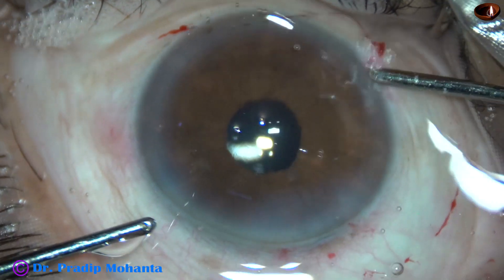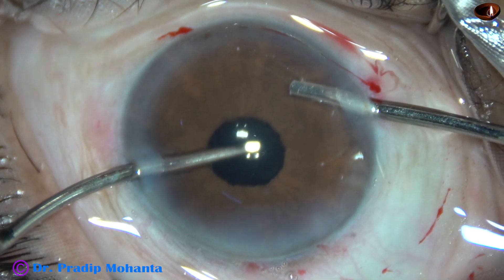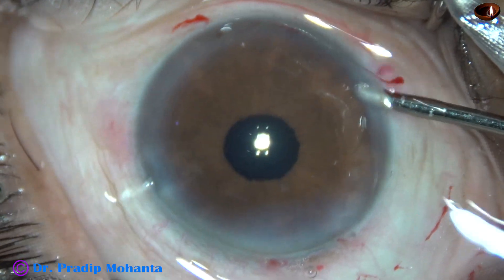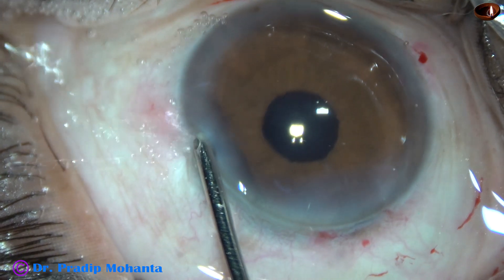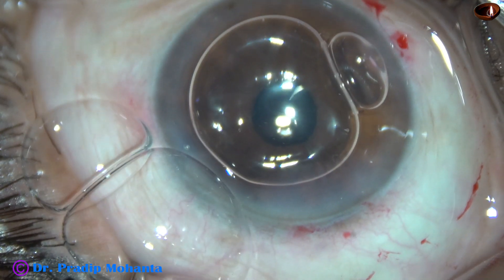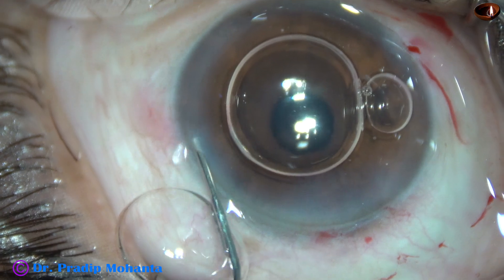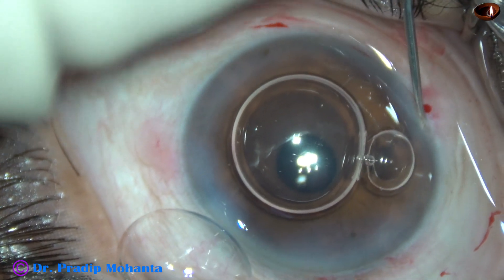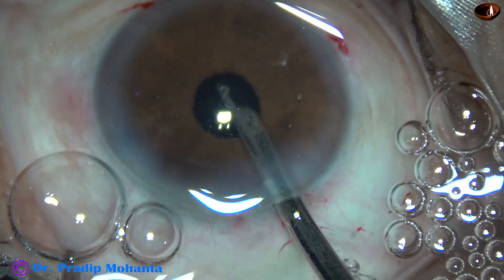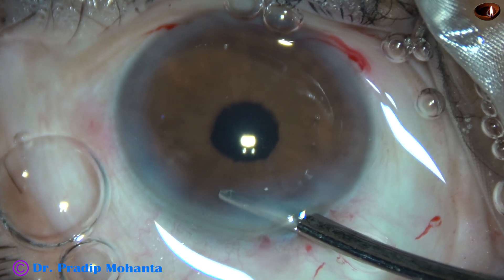See the pupil — it is round and central. This is the beauty of the B-hex pupil expander. If we use iris hooks, sphincter damage is very common. This is the final lavage of the anterior chamber to remove viscoelastic. The anterior chamber was getting shallow, so I take help of an air bubble to maintain it, and hydrate the corneal stroma on either side of the side ports. The anterior chamber is formed very nicely and the case is concluded.